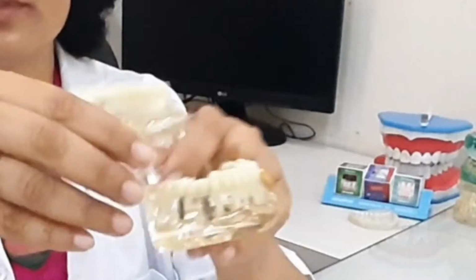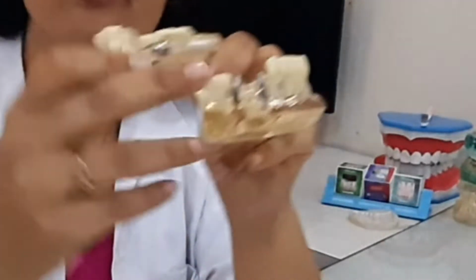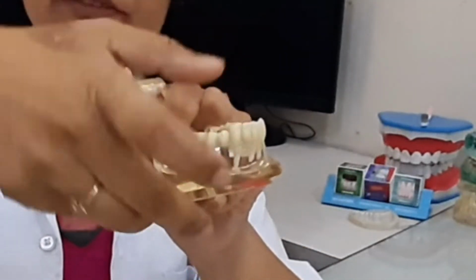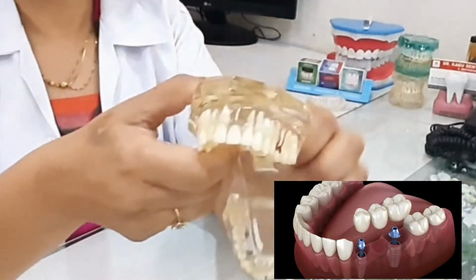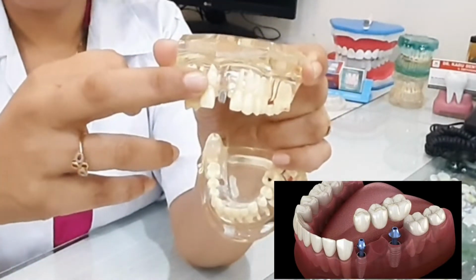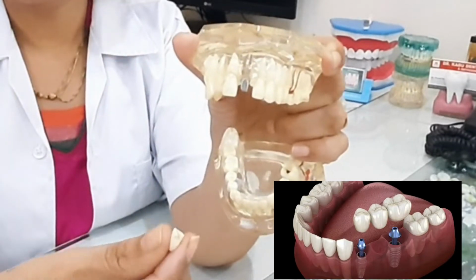Once we are ready with the CBCT scan, we study in detail how many implants have to be placed. For example, in a few cases, it is a single tooth implant, so there will be only one implant. In some cases, there are 3 or 4 missing teeth. In such cases, we put 2 implants and on top of that, we put a bridge, like this. Here the 2 implants are placed and on top of that we can put a bridge. Or there are some single implant cases in which a single implant is placed into the bone and on top of that an artificial crown is placed, like this.